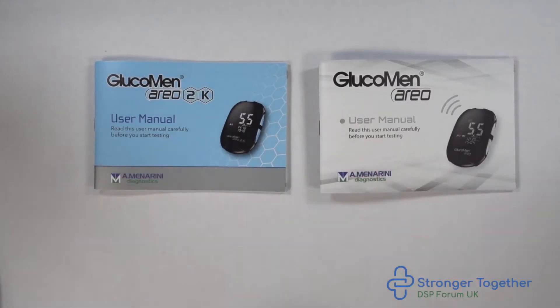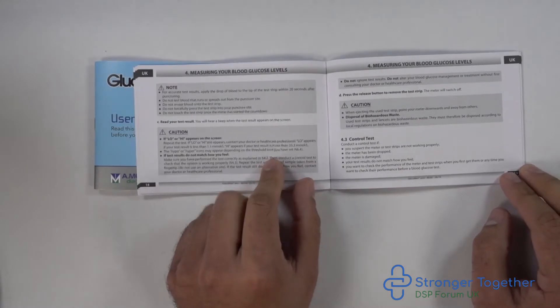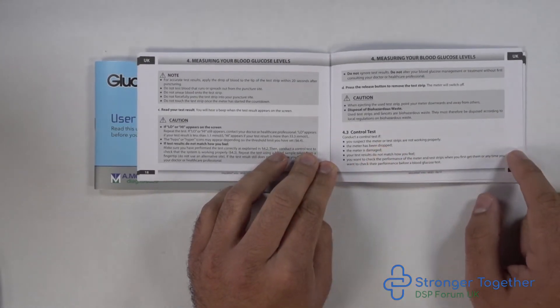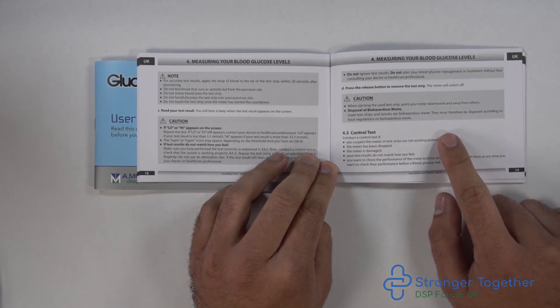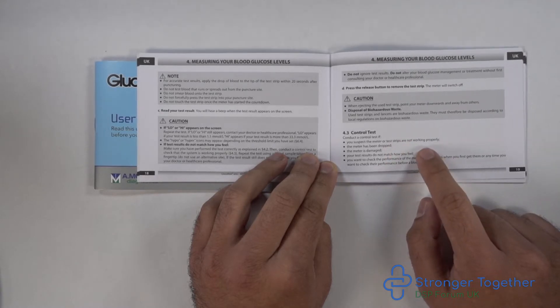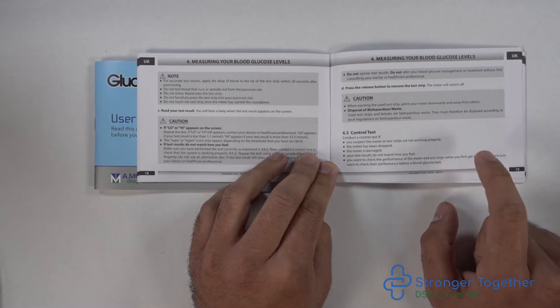The control test ensures your test strips are performing within acceptable limits with your machine. According to the Glucomen Aereo manual, you should conduct a control test if you suspect the meter is not working properly, the meter has been dropped, the meter is damaged, or your blood glucose results do not match how you feel. You should also check performance when you first get your meter and test strips, and I would recommend doing a control test every time you open a new pot of test strips.